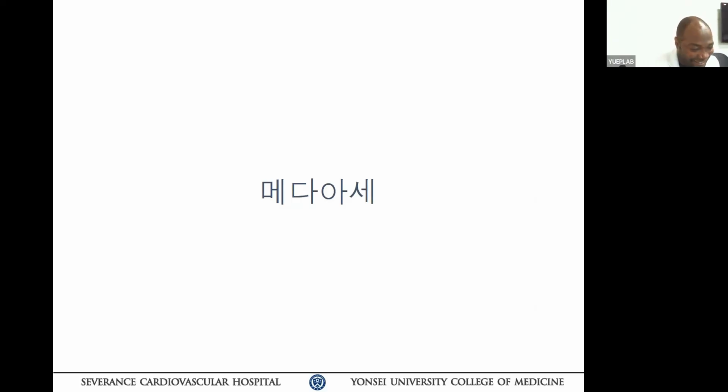So when you do pacemaker implants in post-maze patients, you're going to have a lot of trouble because of this. Just remember, okay? Those are the most challenging cases. Post-maze, Cox maze, I'm talking about full Cox maze, not the mini maze. The surgeon chops out all the sections, so you had better find the measurement.